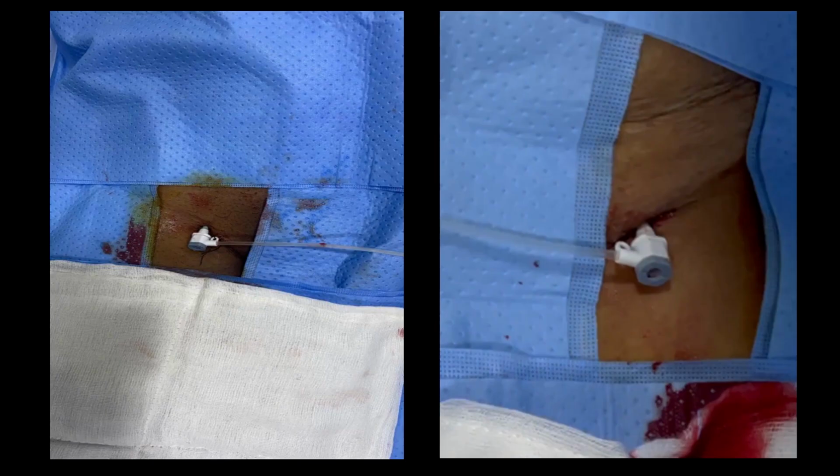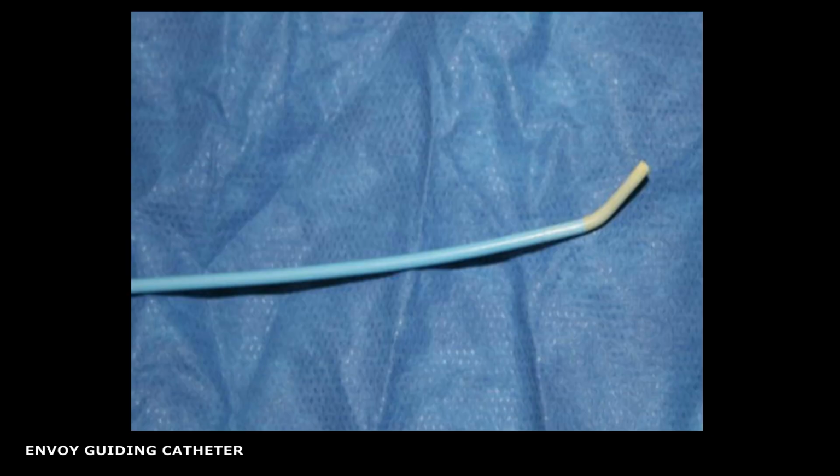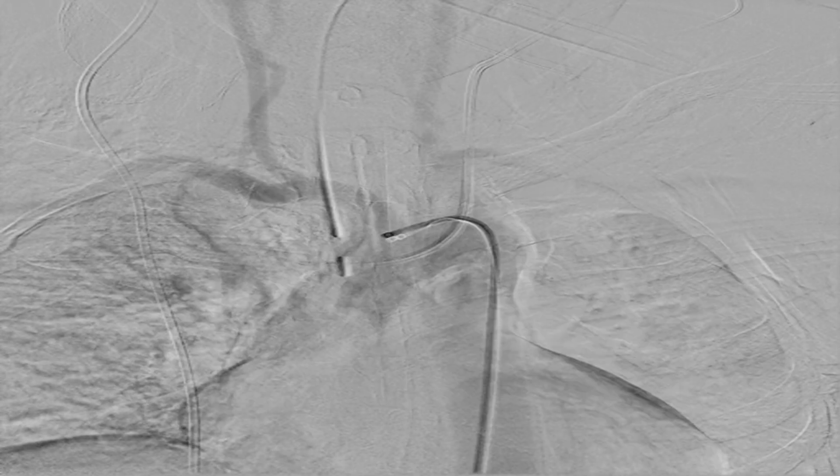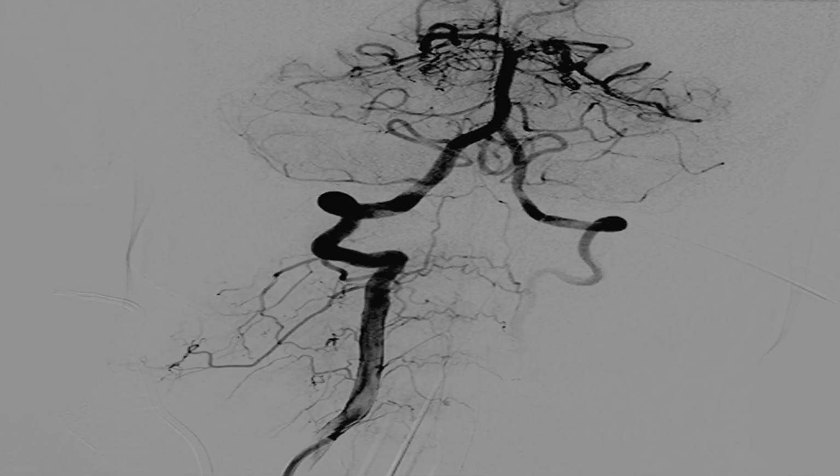After taking consent, the patient was laid supine in the DSA lab. General anesthesia was given. Bilateral femoral artery puncture was done with 8 French femoral sheaths. An Envoy guiding catheter of 6 French was taken up through the left femoral artery and placed into the right vertebral artery. This was done so as to get cross flow and make road maps for the procedure.